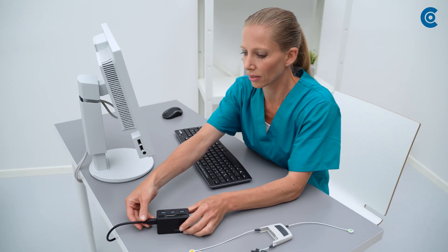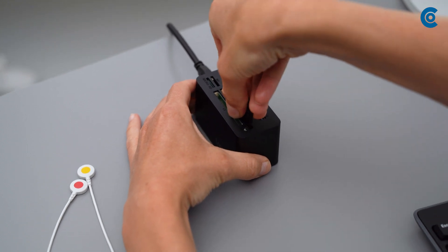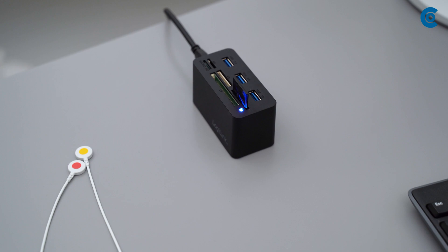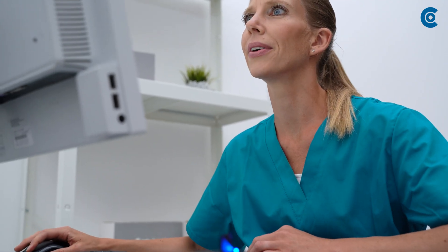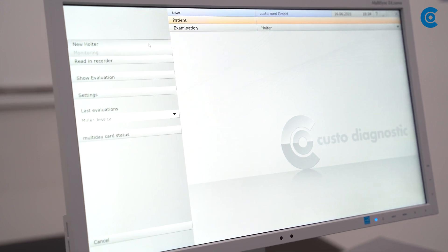First, make sure that the USB card reader is connected to the PC, and then insert the Custo Multi-Day card into the card reader. Start Custo Diagnostic and select Multi-Day card as Holter ECG Recorder.